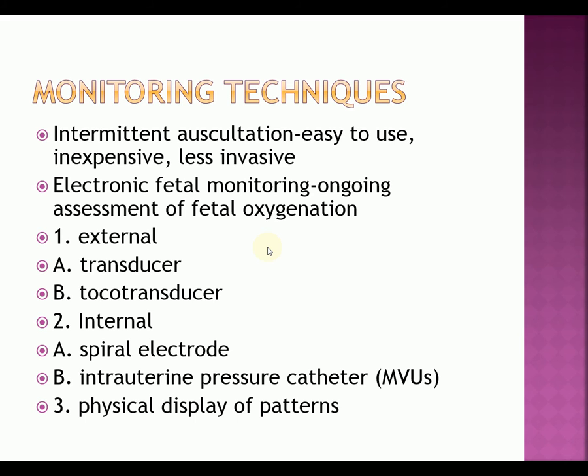If you look in your book on page 414, the basic fetal monitoring setup is the one down at the bottom of the page, where the patient's strapped. She's got a pink strap on the bottom, a blue strap at the top. One of them's reading the fetal heart rate, and one of them's reading the contractions. So basically, the ultrasound transducer is the one on the bottom reading the fetal heart rate. They know the fetal heart rate is there because they did Leopold maneuvers and figured out the baby's back is in that direction. So that's where they put their monitor.